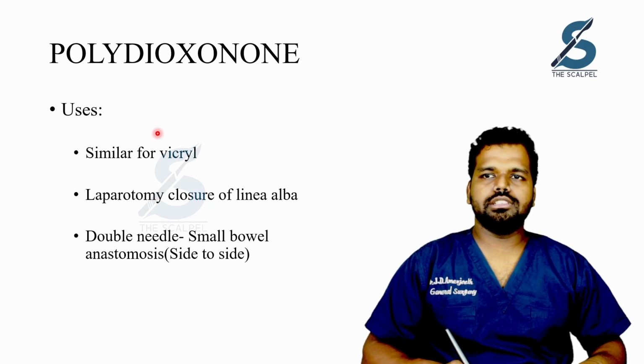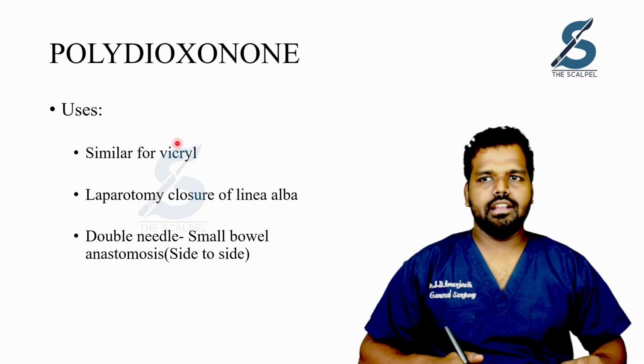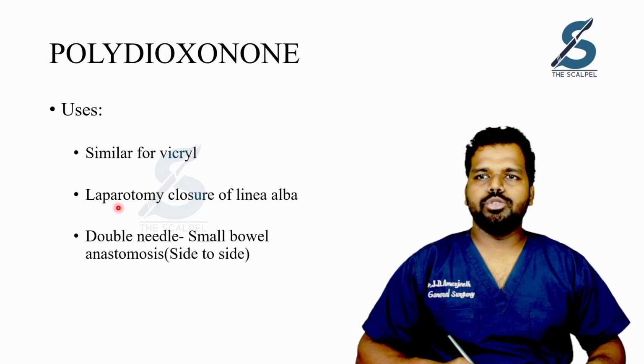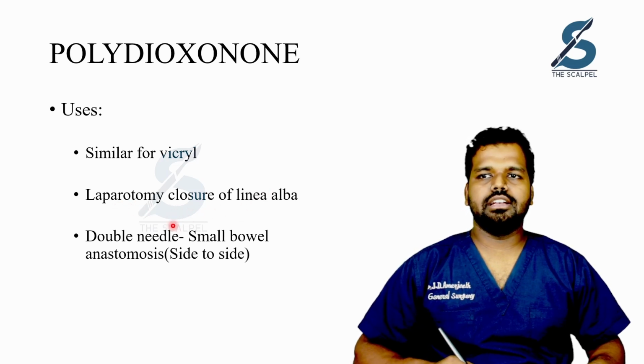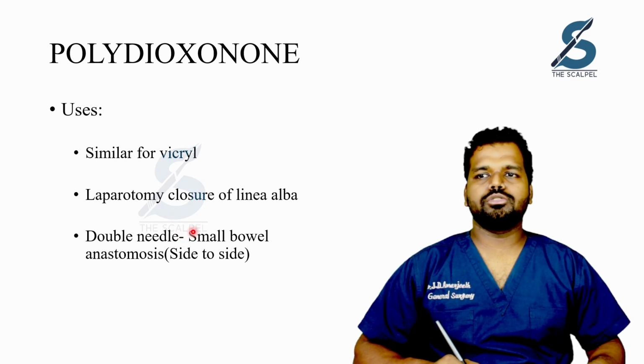Coming to the uses, it is very similar to Vicryl. It is especially used for laparotomy closure of the linea alba, and the double needle is used for suturing small bowel in the case of a side-to-side anastomosis.